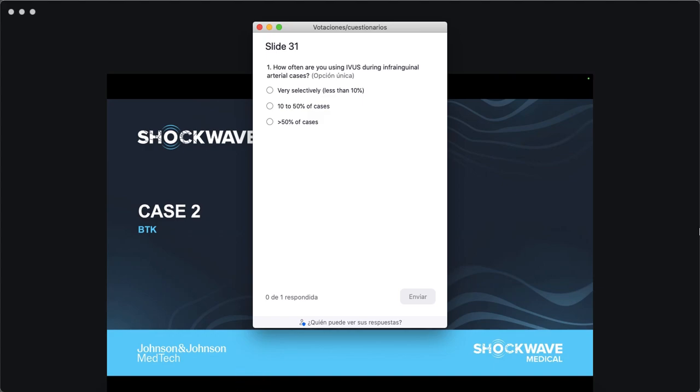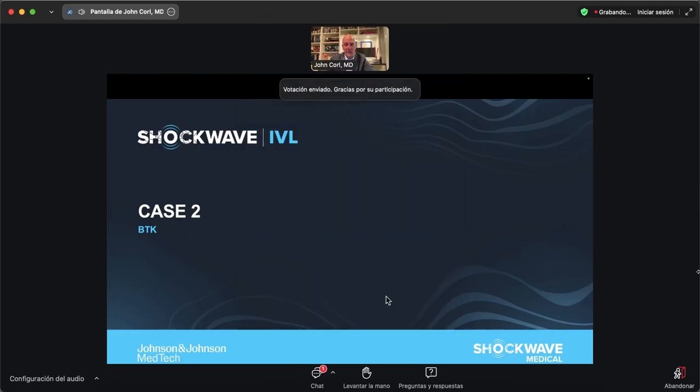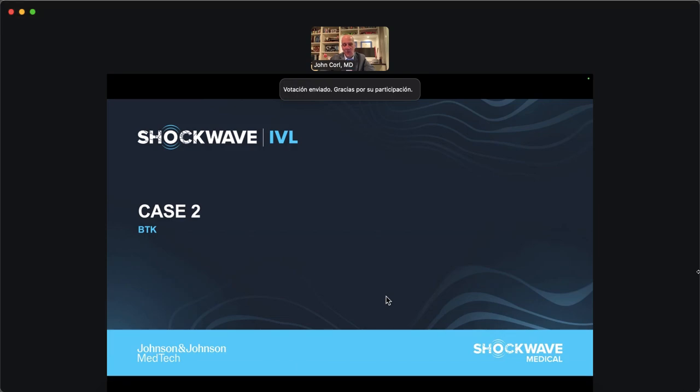So JD, you said you pretty routinely use IVUS. So what do you consider to be routine? Is this most cases for you? Yeah, I think pretty much every case. Now, the only exception is if you're radial and you're using some of the Sublime equipment with the 250 shafts, obviously you're not going to reach with IVUS. So those you're limited there. But if I can get an IVUS there, I don't think it's a big deal. We're so used to doing it. It's like 2 minutes to set up and 3 minutes to do. It's literally 5 minutes of time. So we get a ton of information.